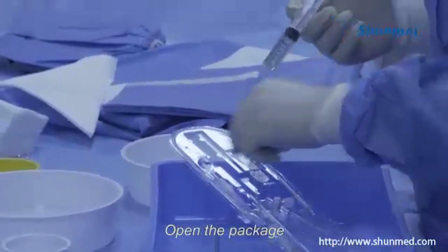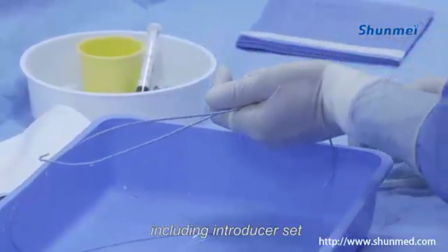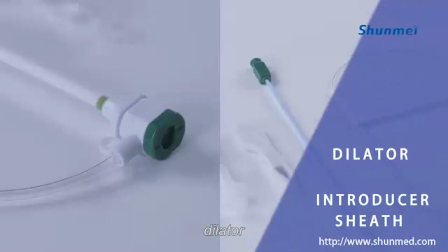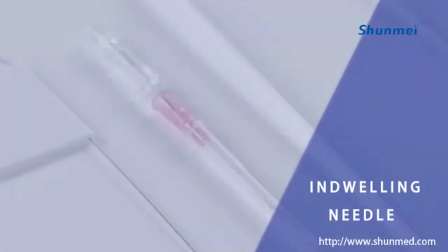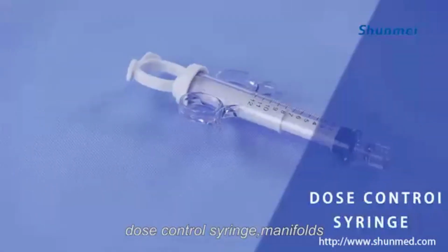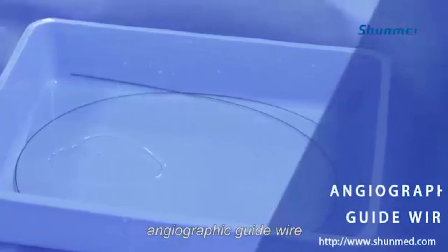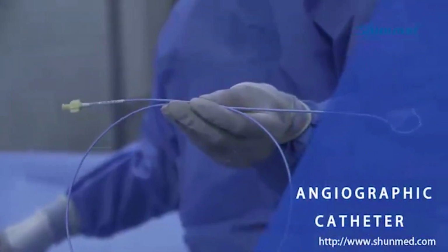Open the package. Prepare the medical devices for PCI surgery, including the introducer set, introducer sheath, dilator, guide wire, indwelling needle, disposable pressure transducer, dose control syringe, manifolds, angiographic guide wire, angiographic catheter, etc.